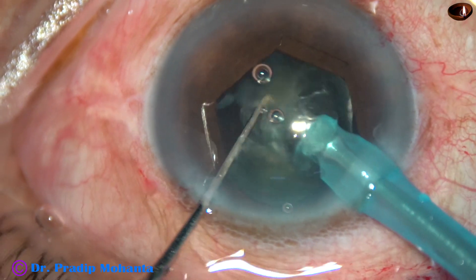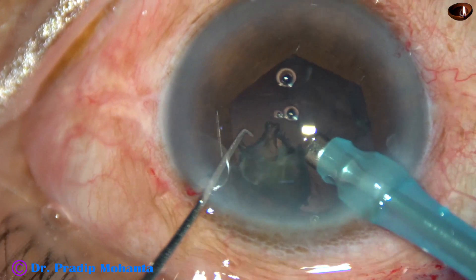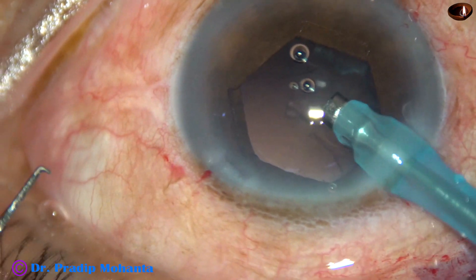The iris is at its original plane — it is not elevated at all. The nucleus has been managed.